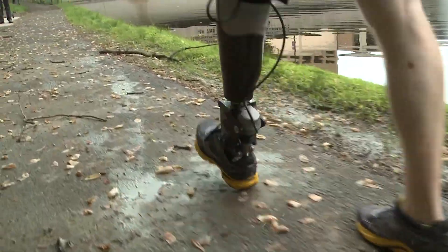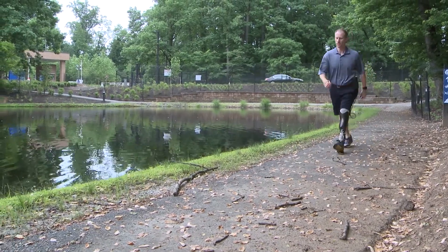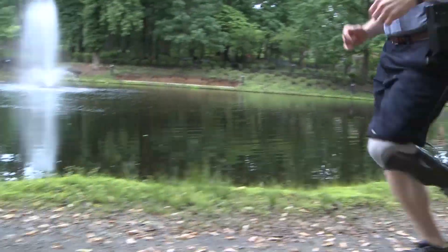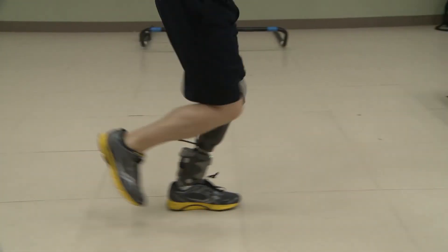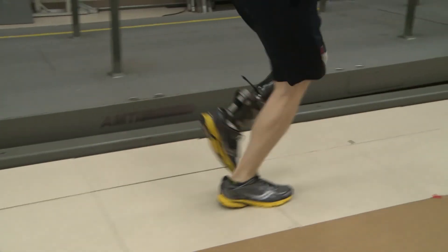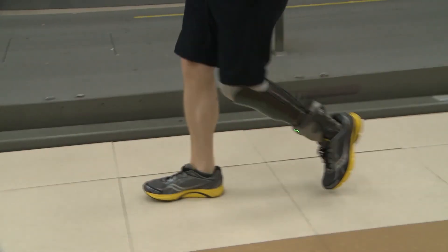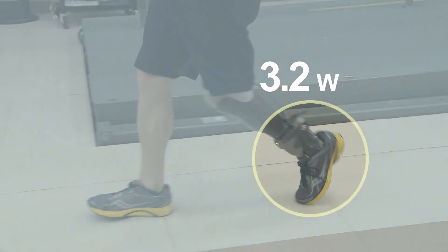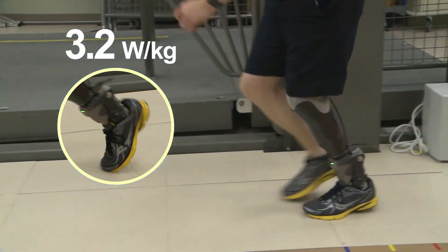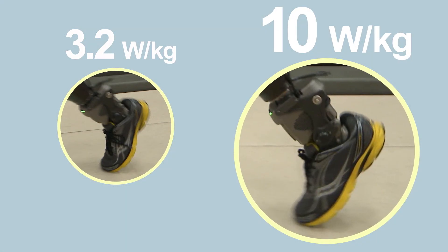This particular unit was designed to support a 100 kilogram user because the demands of running are tremendous. When running, there's 800–900 pounds of force in the spring in the foot — a tremendous amount of load on all of the internal components. For walking, you're looking at on average 3.2 watts per kilogram peak power at the ankle joint. For running, that goes up to 10. So the loads and demands are much higher, which is why we've designed this for a 100 kilogram user.